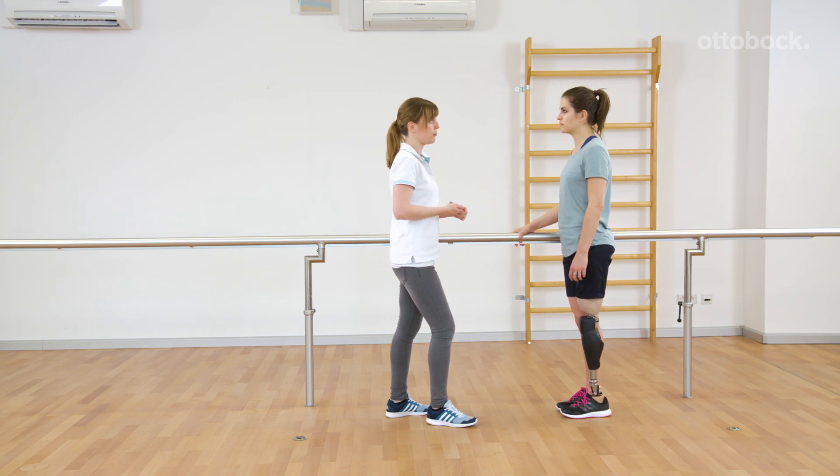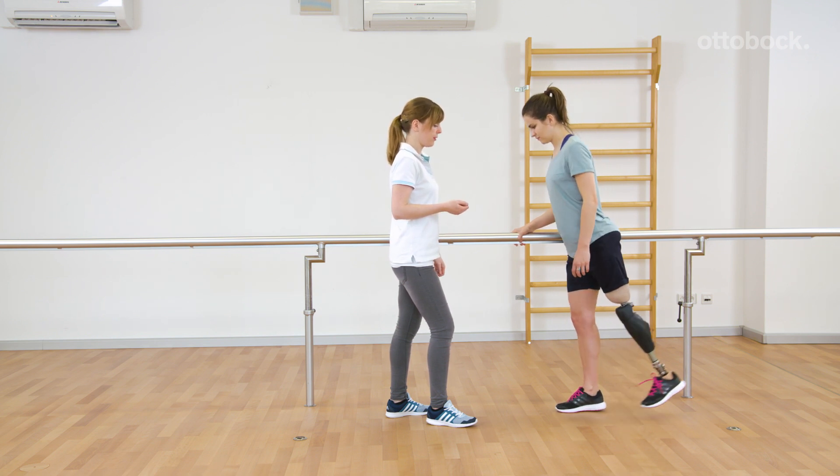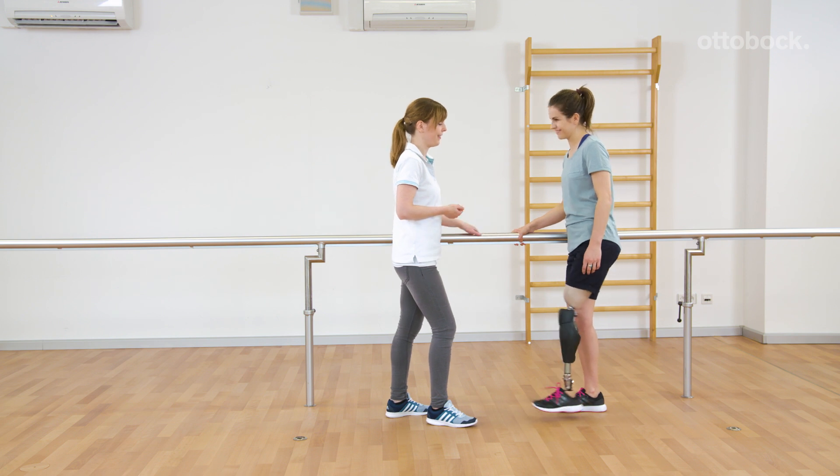Direct switching between the two my modes is not possible. With four times bouncing and unloading, Reka can switch into the second my mode. Three short beeps confirm the switching. Here cycling is shown.